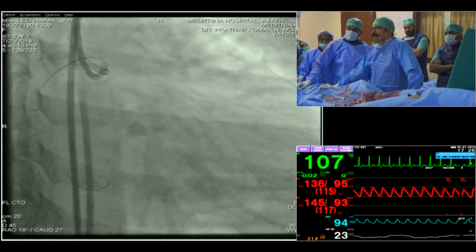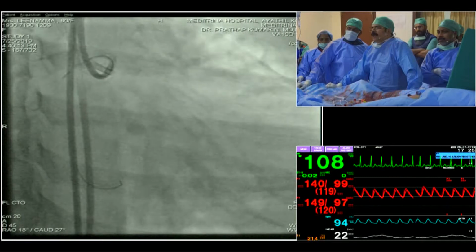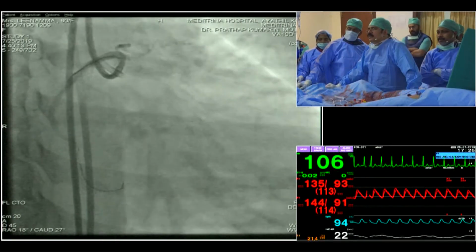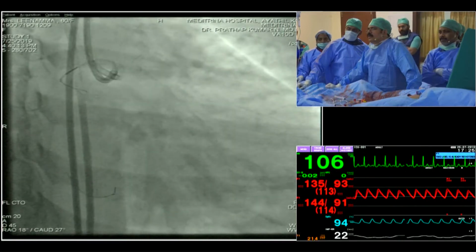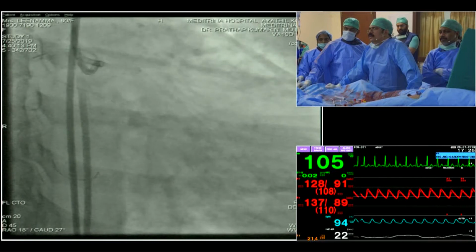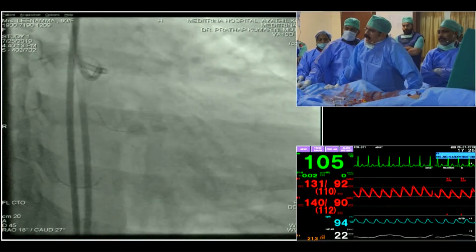I actually have another question, if I can. Do you routinely use the Judkins right for retrograde approach, considering that probably the majority of the operators would have taken an AL1 for this kind of indication, considering the need for support? What is your approach in terms of catheter and support determination before planning?